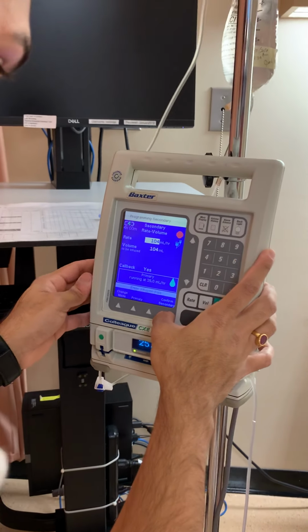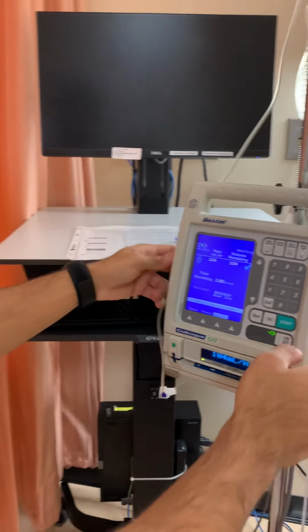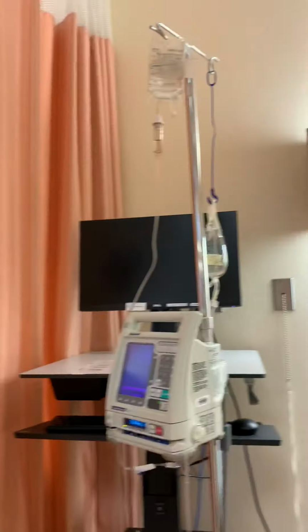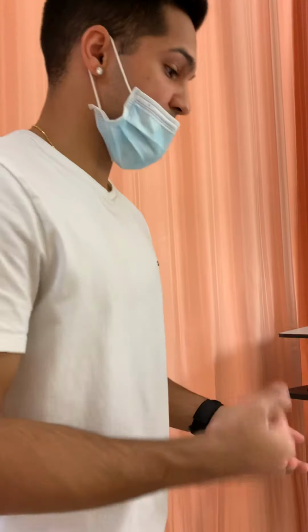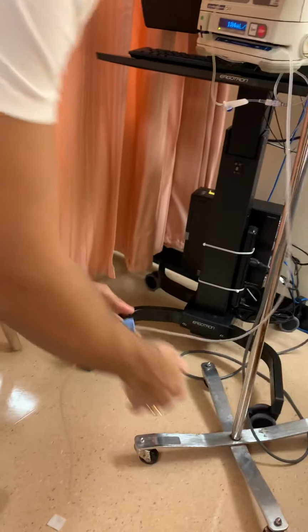Okay, so I'm just going to confirm secondary and start. And I'm just going to be making sure all my clamps are open, and I'm watching for these 3 drips in my chamber. And the 3 drips have started, so I know it's infusing. And I'm just going to be making sure callback is on for my pump, so therefore I can come back within an hour, flush my secondary line with 15 mLs of normal saline, so my patient gets the full dose. And I'm just making sure all my clamps are open and everything.